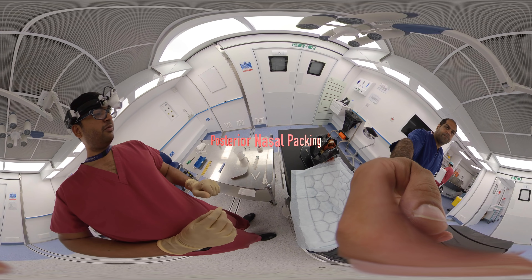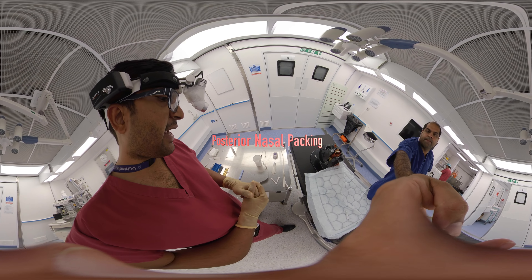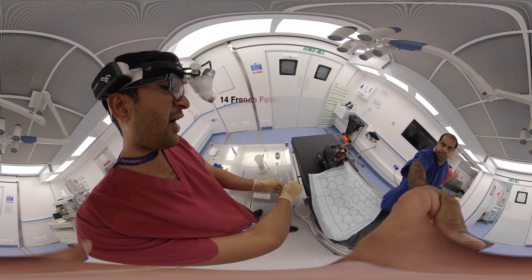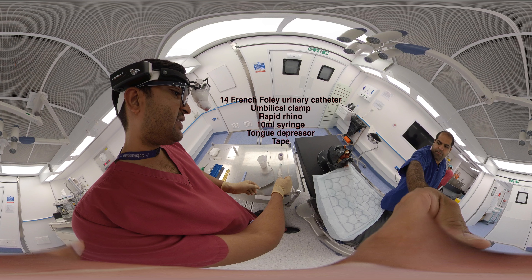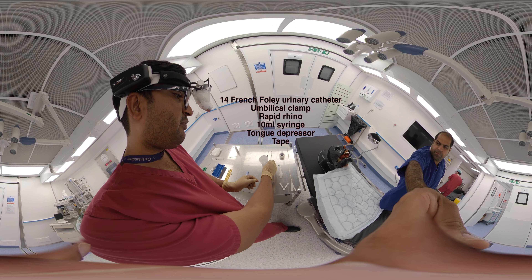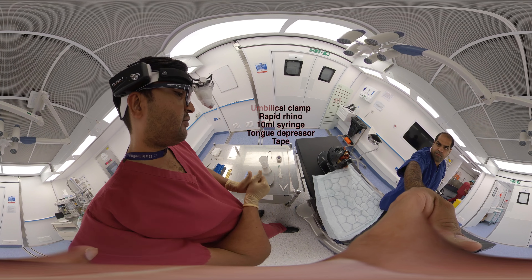Welcome everybody. I'm going to demonstrate post-nasal packing. The equipment needed includes a 14 French Foley catheter, umbilical clamp, 10 ml syringe, tongue depressor, rapid rhino, and tape.